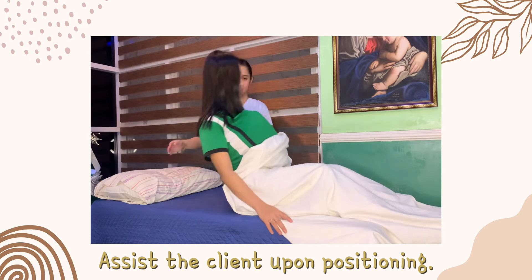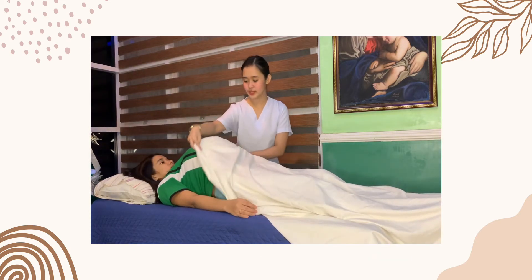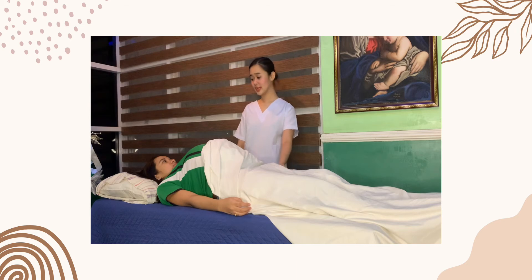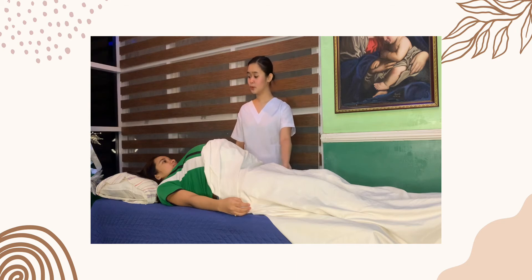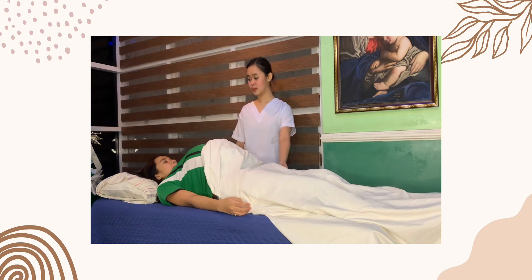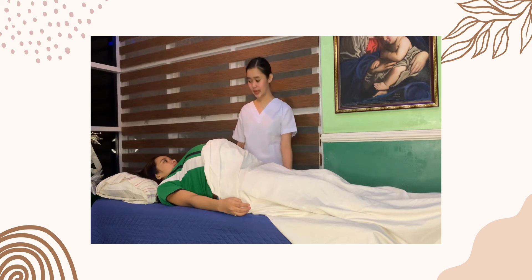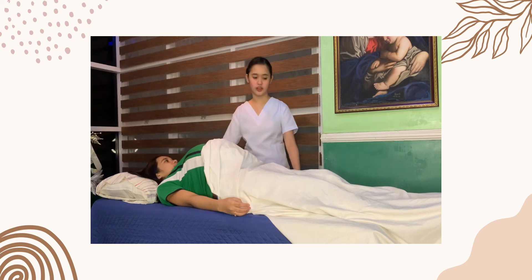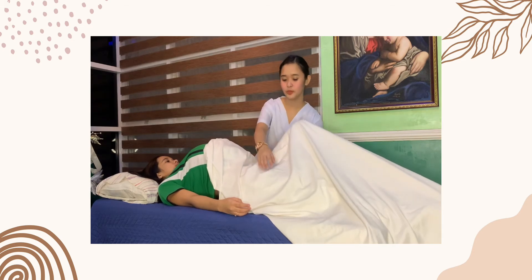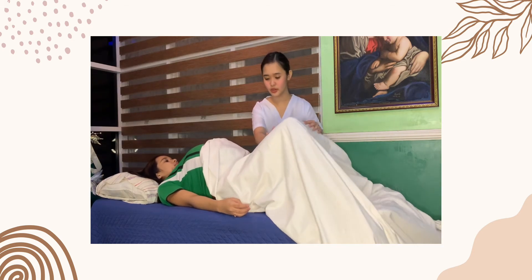Pwede na po tayo humiga. Comfortable po ba kayo? Yes po. So itataas po natin yung both legs niyo kasi kailangan po naka-dorsal recumbent position po tayo para mabawasan yung tension sa ating abdomen. Okay po ba yun? Okay. Itataas lang po natin ito. Then buka ka po tayo ng konti.